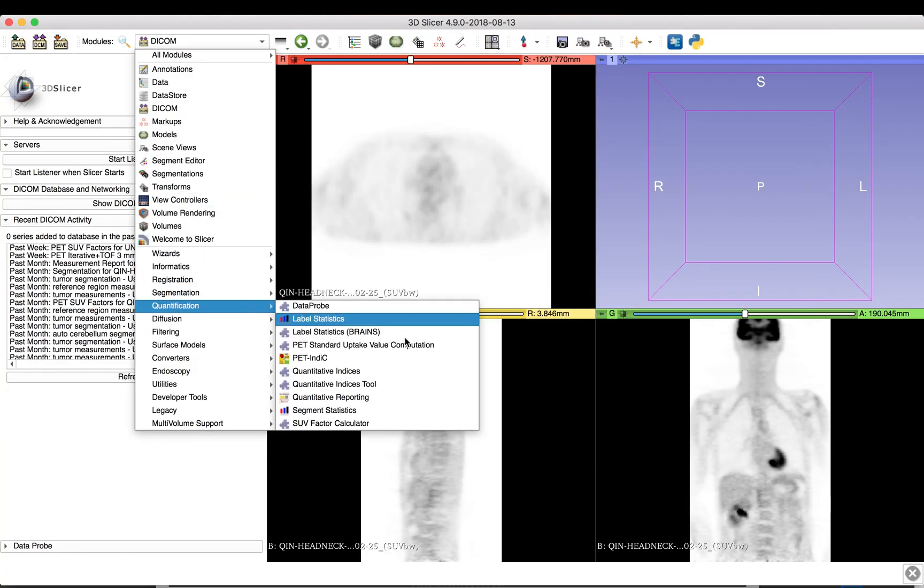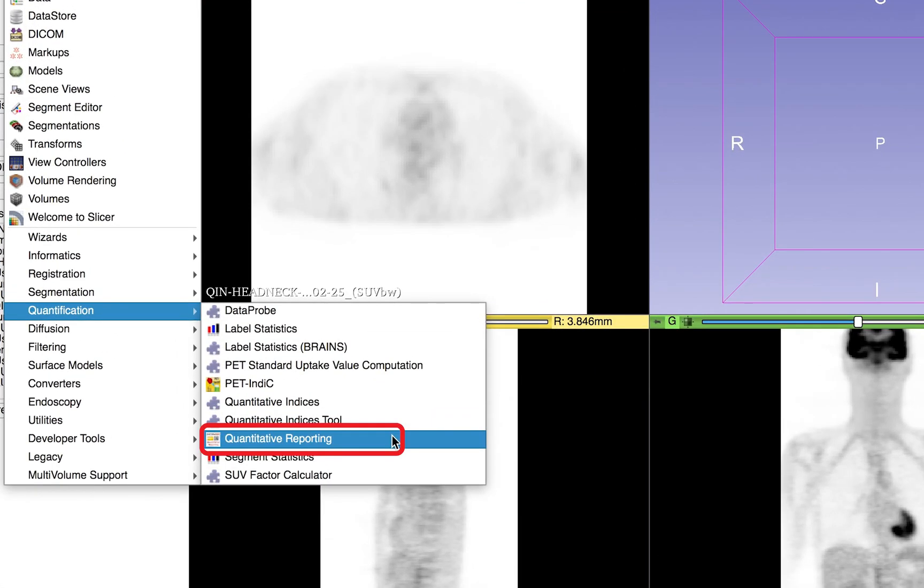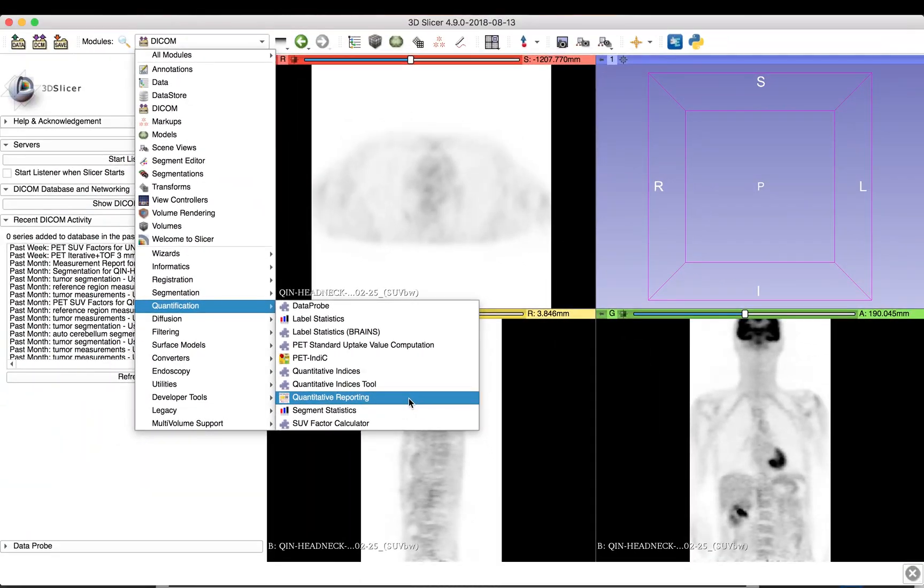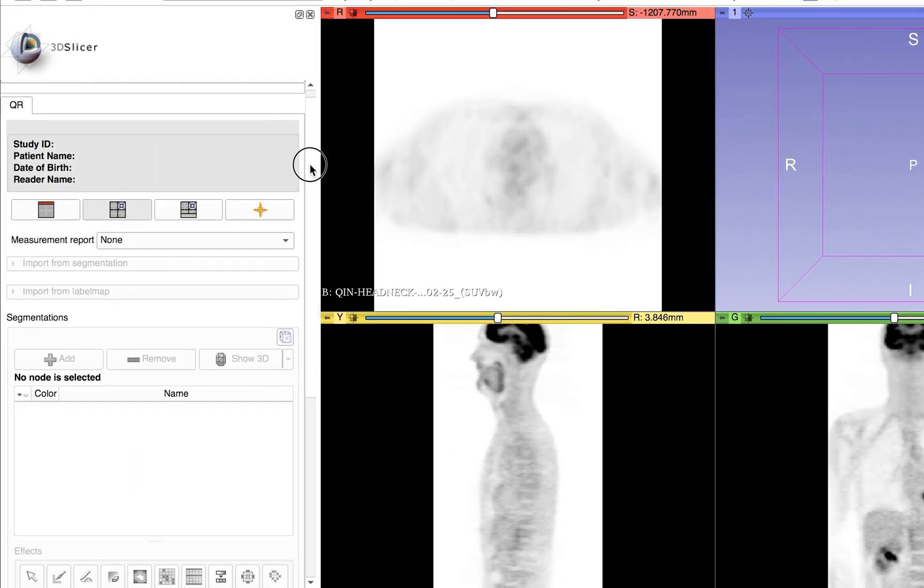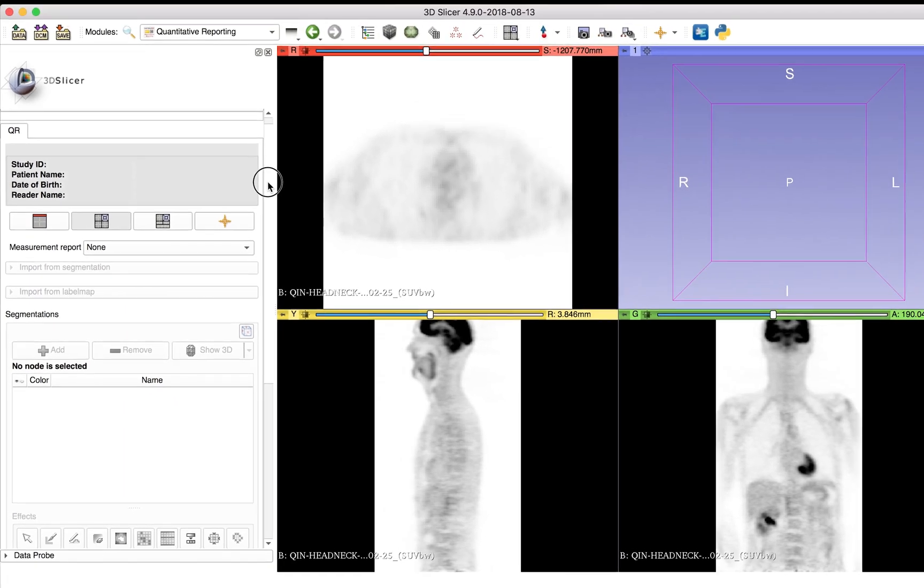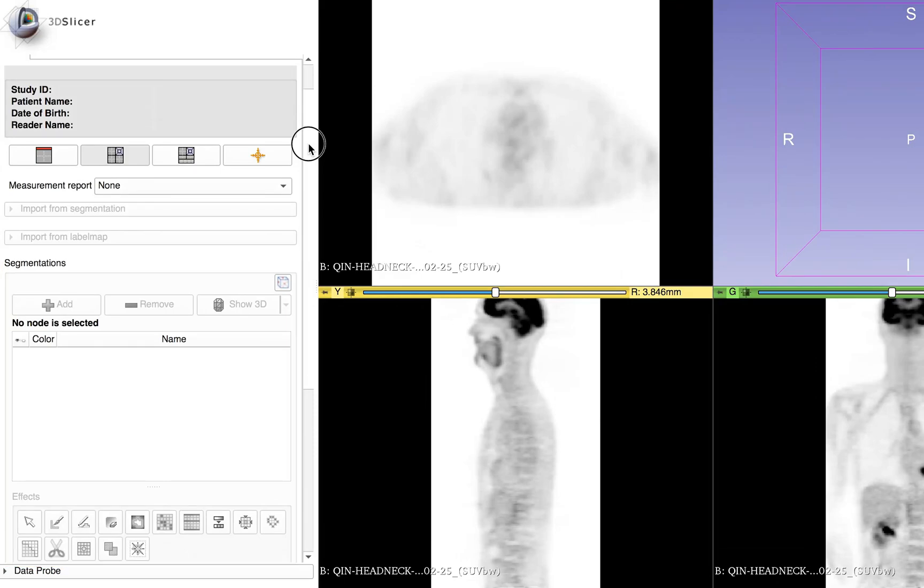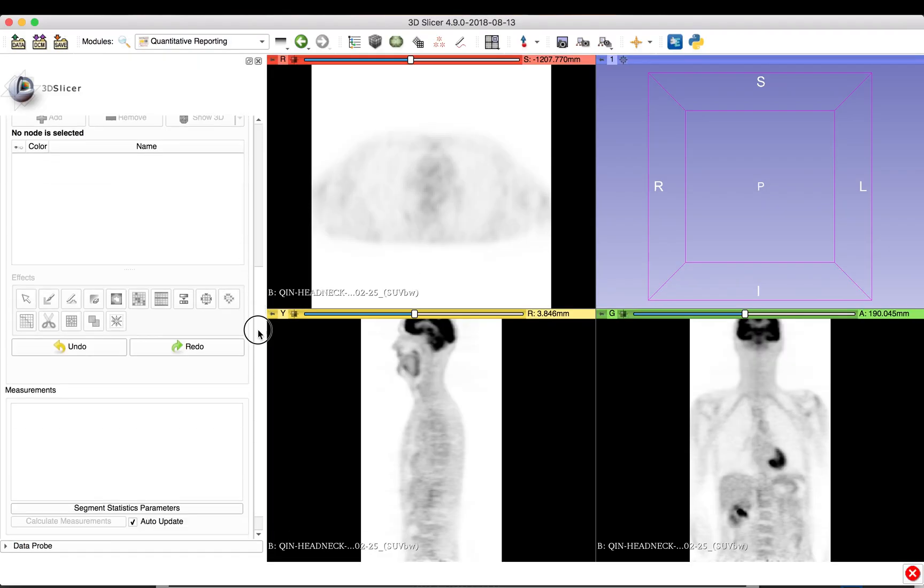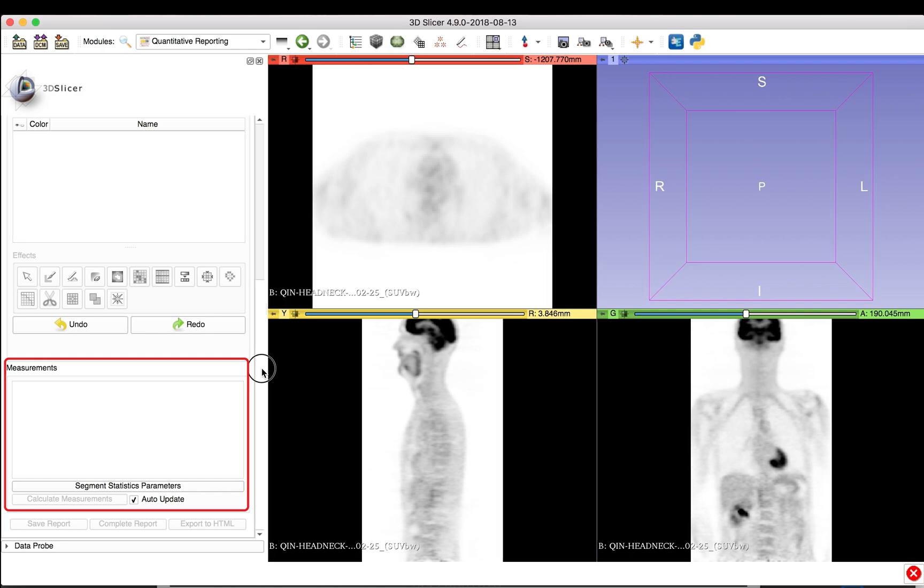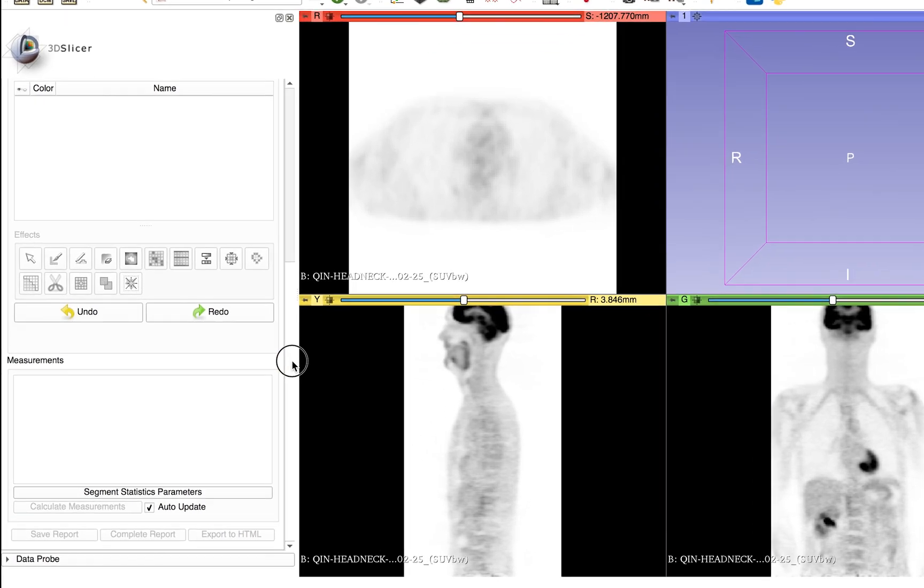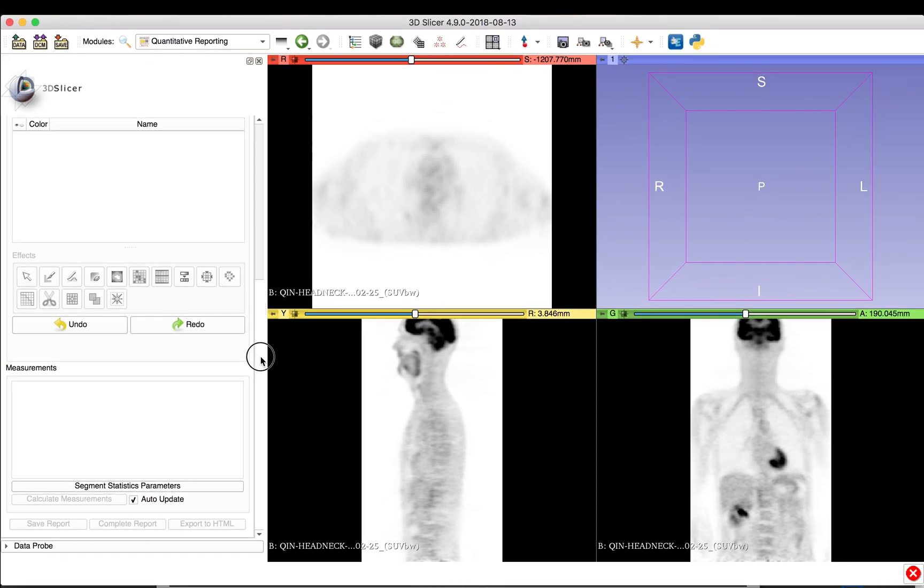Once the data set is loaded, select the Quantitative Reporting Module under the Quantification fly-out menu. The Quantitative Reporting Module consists of several areas, most importantly the selector area to start a new measurement report, a segmentation area for manipulation of segmentation objects, also known as segments, a measurements area to configure the set of desired quantitative indices and to check obtained measurements, and the report buttons area for saving results to DICOM.